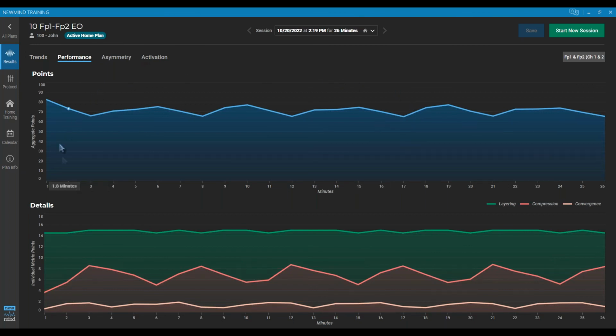Keep in mind that you might get a panic call one day if you allow those session results, where the client calls you and says, hey, I've been averaging 60, 70, 80 points on all my sessions, and all of a sudden today I only had 10 points, or maybe I had no points at all. Is my brain broken? What's going on? Is the equipment broken? I've heard a ton of different things.